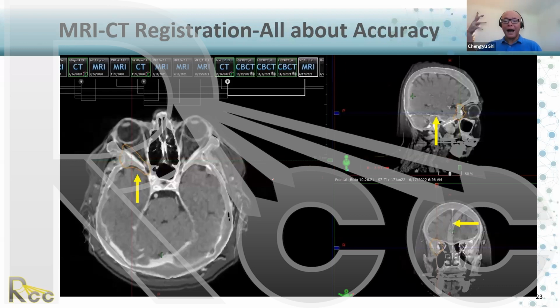And in your head, you have the visualization of what a CT is, what an MRI is, and whether this MRI is roll, or pitch, or yaw rotation first, mainly, and then adjust it to match the tumor, nearby organs and further organs. Otherwise, you may come out with a solution where the nearby tumor matches, but the further organs mismatch. And then you have difficulty later on. Either the OAR match or you cannot match well at the treatment.